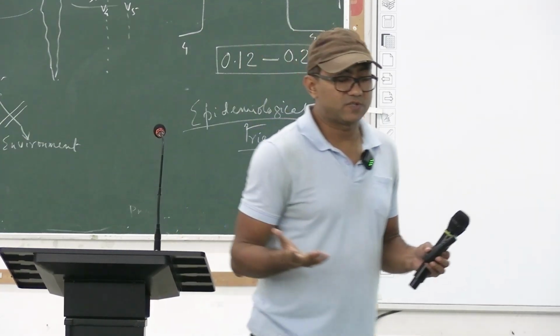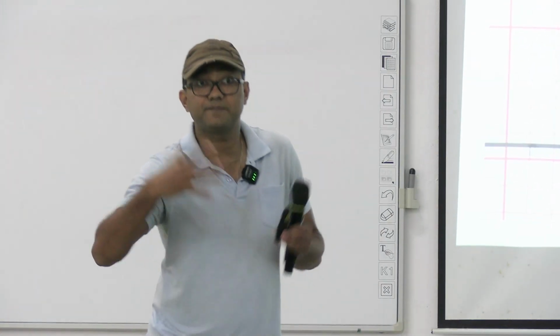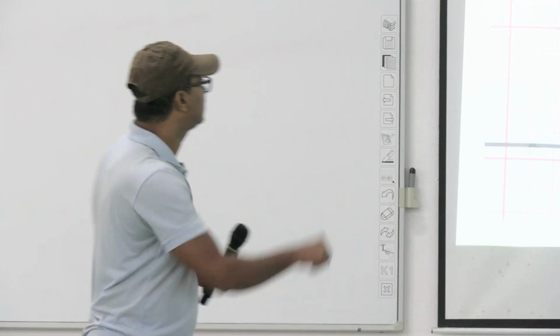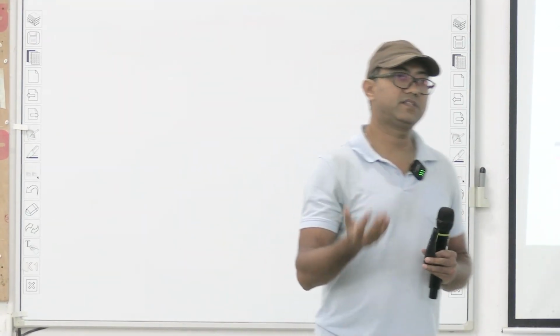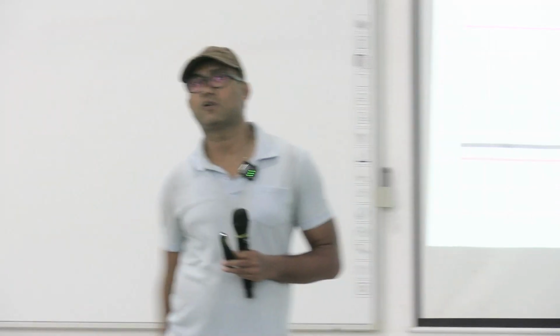There are other examples as well. We talked about ventricular hypertrophy, when your left ventricle or right ventricle is getting hypertrophied, muscle mass is more, again this voltage will be higher, right? Clear? So what are the causes? The question may come in this way: what are the causes, or tell me one or two causes of high voltage ECG and one or two causes of low voltage ECG.